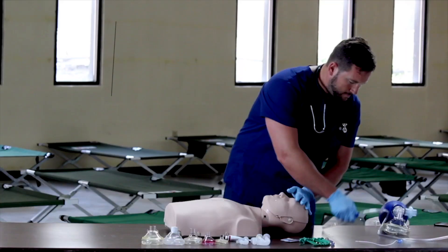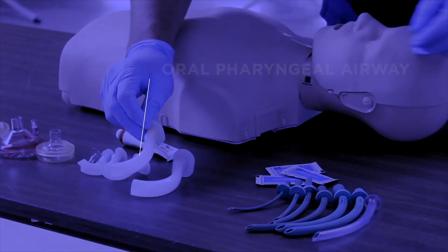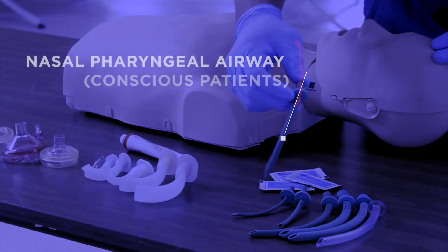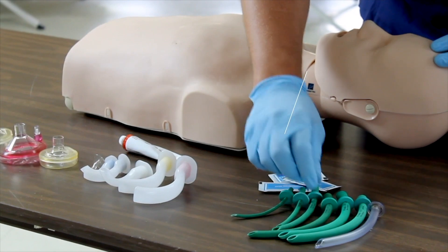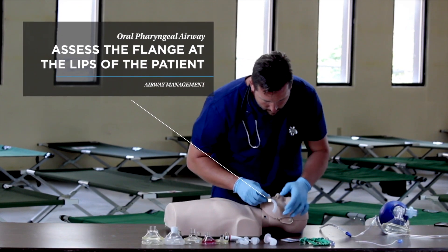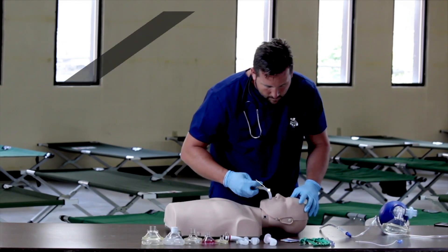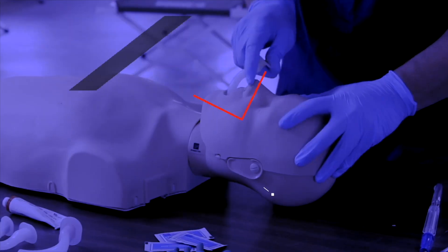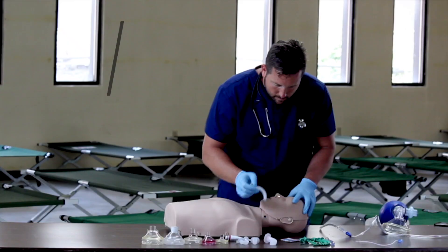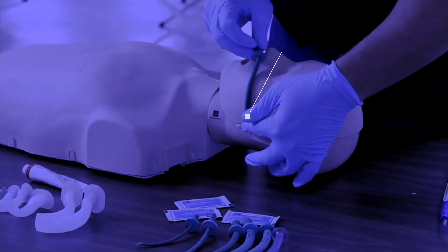Now that the airway is open and clear, consider a couple of airway adjuncts to maintain patency. There are two main types: the oropharyngeal airway for unconscious patients and the nasopharyngeal airway for conscious patients. Selection of the proper size oropharyngeal airway is done by assessing the flange at the lips of the patient — the tip of the airway should be at the angle of the jaw. Selection of the proper size nasopharyngeal airway is done by assessing the flange at the nostril — the tip should just reach the tragus of the ear.